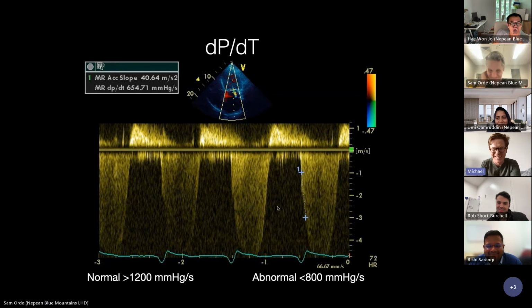I don't remember exactly why. It plugs into an equation, and those numbers work well. I mean, it's just 4V squared, right? So you can estimate what the pressure is at 1 meter per second. You can estimate what the pressure is at 3 meters per second. So it's 3 squared, which is 9, times 4, which is 36. It always gives you 32.